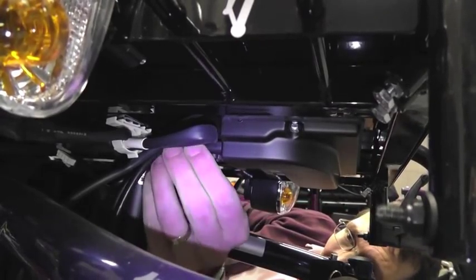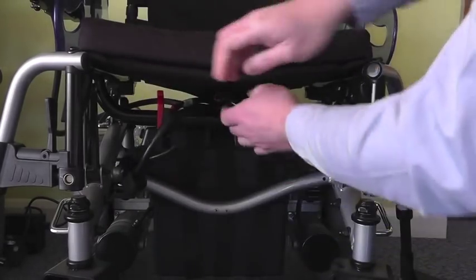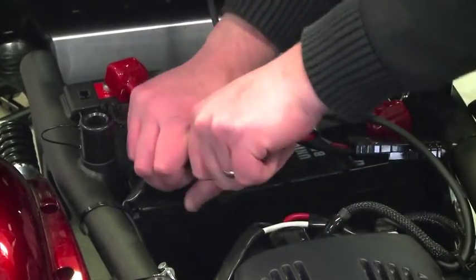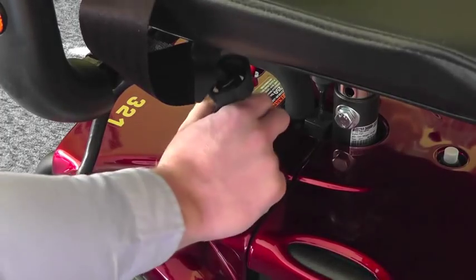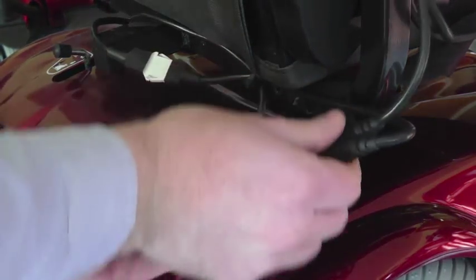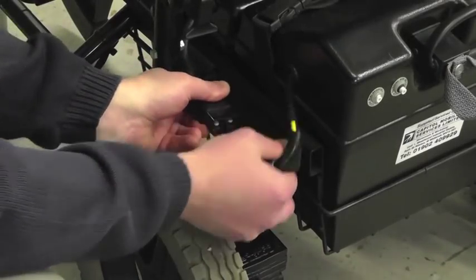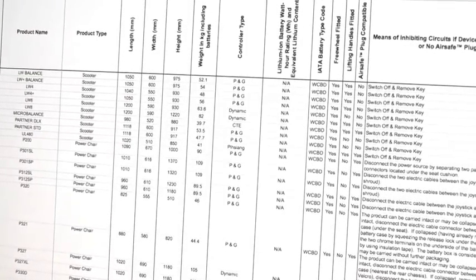Breaking the power supply is achieved by separating or unplugging power cables as specified by the manufacturer. Connectors like these may be located under the seat or under a shroud near the batteries; they are separated by gently squeezing and pulling each side apart. On some products, cables plug directly into the body of the power chair or into the joystick controller. Most connectors and plugs are shrouded to protect the terminals inside from short circuit, but if you find any exposed terminals, protect these with insulation tape. The BHTA log explains how the appropriate cable, plug, or connector is found for each power chair listed.